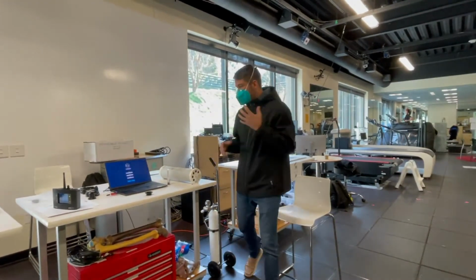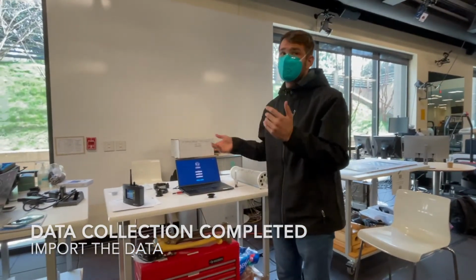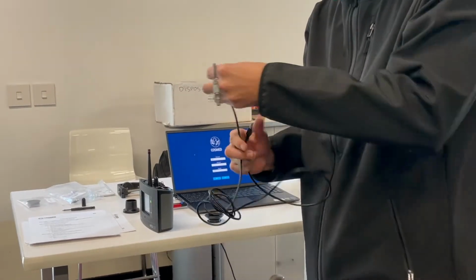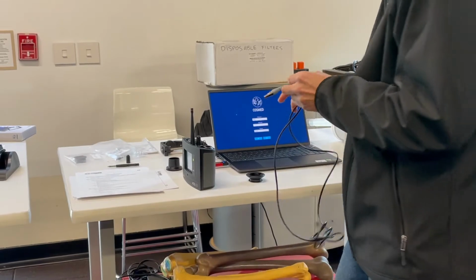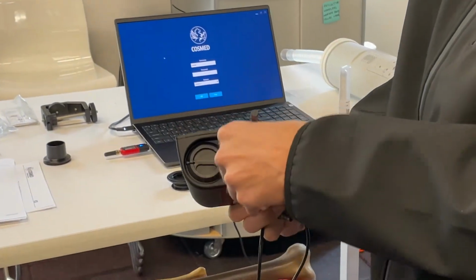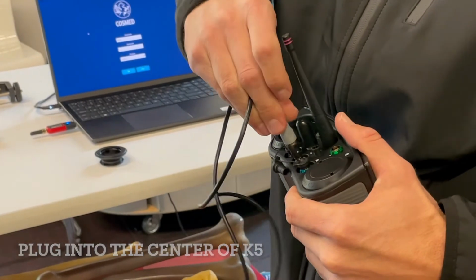Okay, so now we ran our test. We want to now import the data that we just collected onto the computer into the Omnia software. So first thing we're going to do is plug it in. And like I showed you guys before, it's labeled, power supply, USB, and then the extra heart rate. So it's just going to go right in the center.